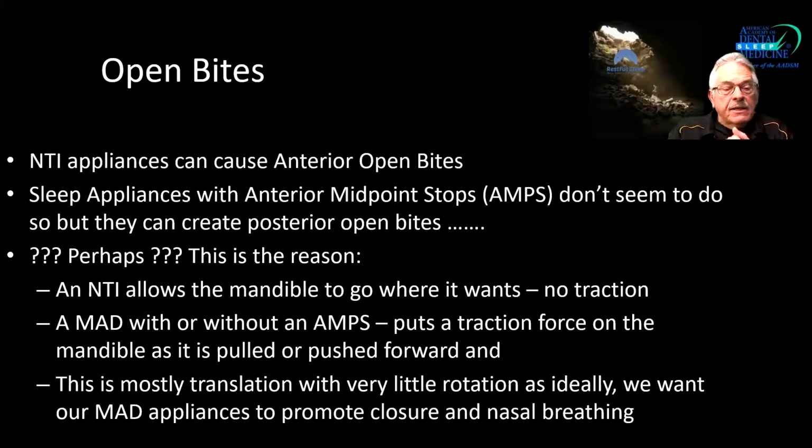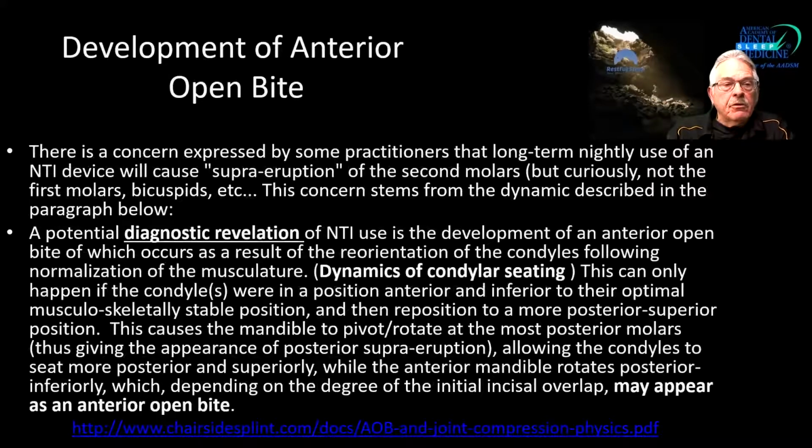And this is mostly translation with very little rotation, because we really would also like the patient in the mandibular advancement device to have lip closure, therefore nasal breathing. So we try to even eliminate rotation of the mandible by elastics or lip tape or something to keep the mandible closed. And we're going to look into this a little bit more clearly here, I hope.